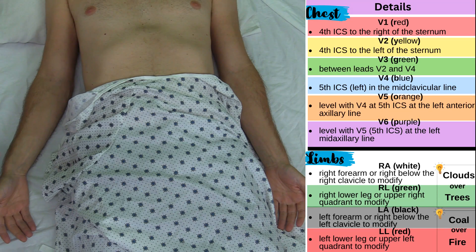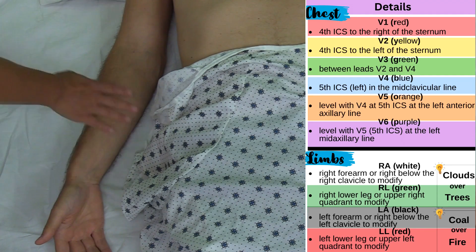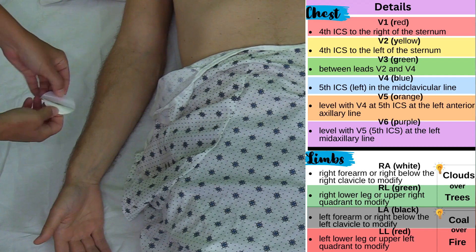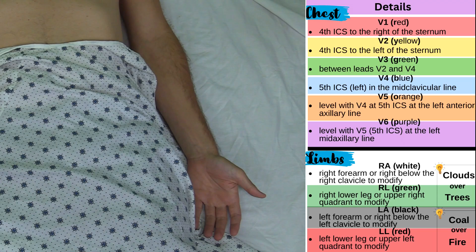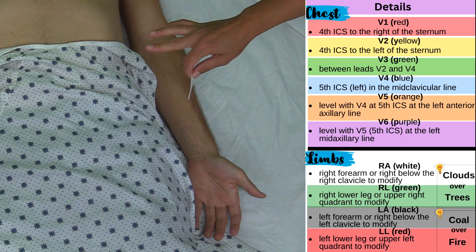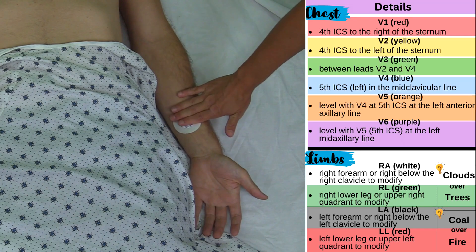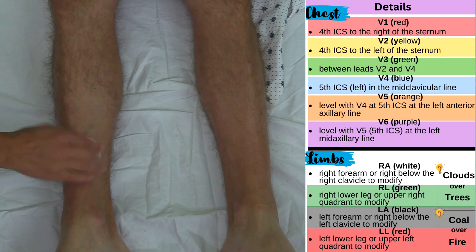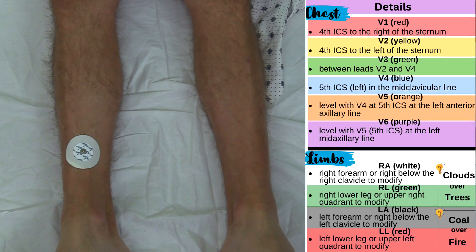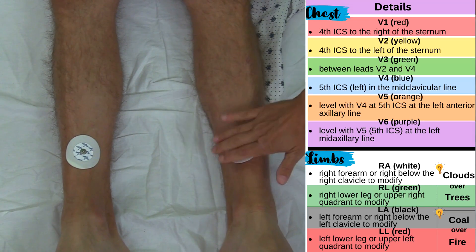Now I'm going to place the limb electrodes: right arm, left arm, right leg, and left leg. Beginning with the right arm, I want to go just above the wrist in about the forearm area. I'm going to take the electrode, pull the backing off, place it right here, and push it down so it sticks firmly. Then I'm going to come to the left arm and put the electrode in about the same place I did on the right side — I want them to be equal. Now I'm going to come to the right leg and go above the ankle and place the electrode here, pressing firmly. Lastly, I'm going to come to the left leg and place this electrode equal to the right leg.